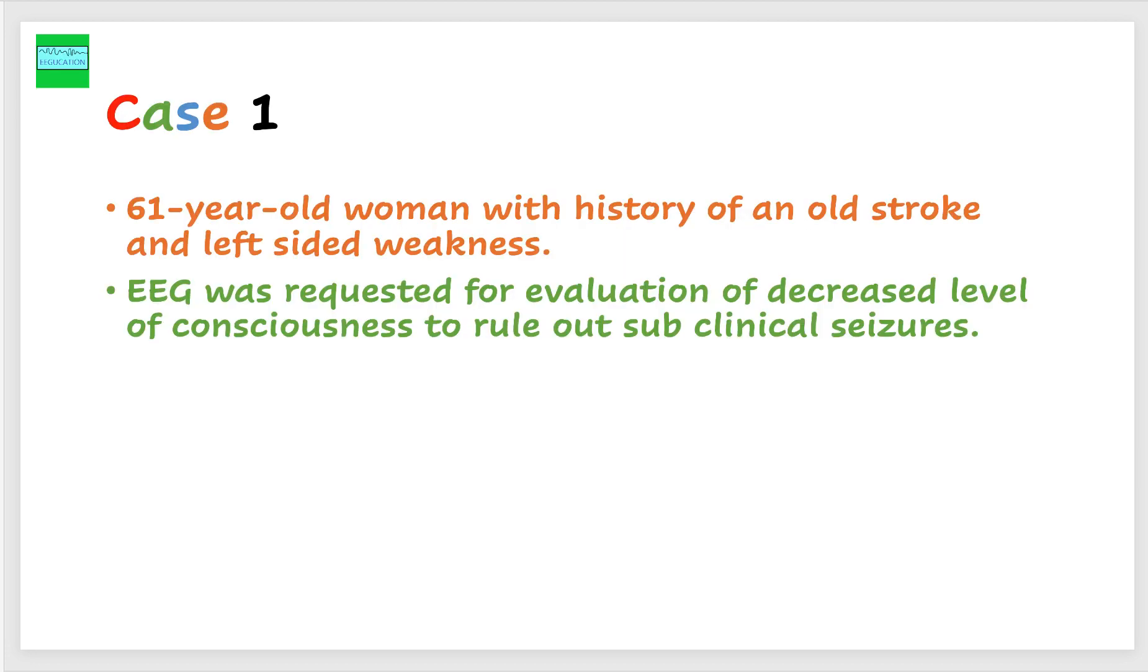This is a 61-year-old woman with a history of an old stroke and left-sided weakness. EEG was requested for evaluation of decreased level of consciousness to rule out subclinical seizures.